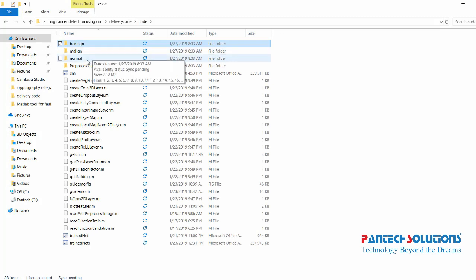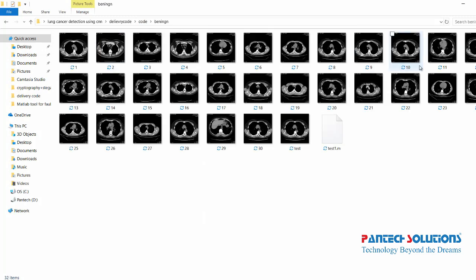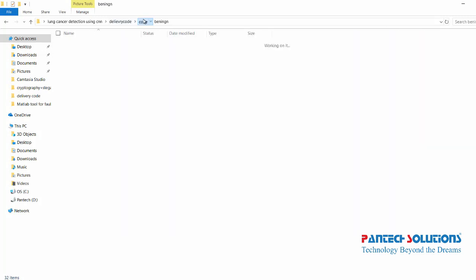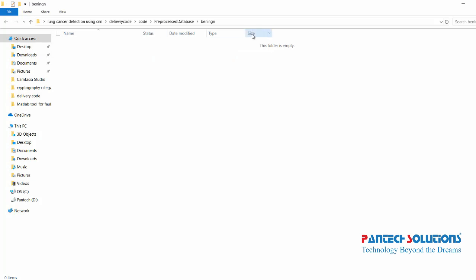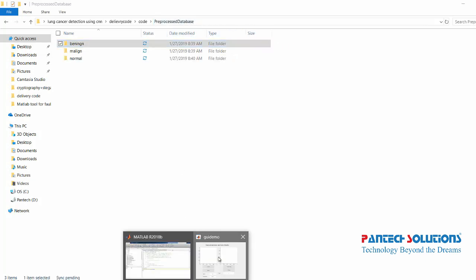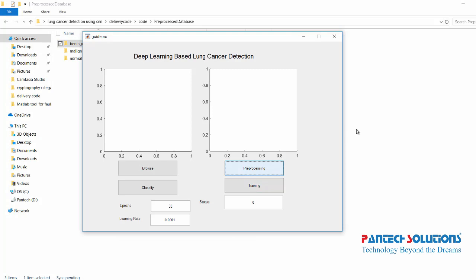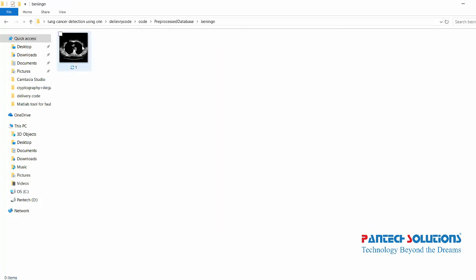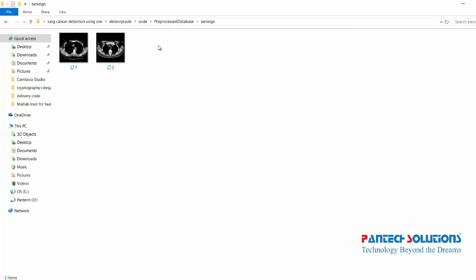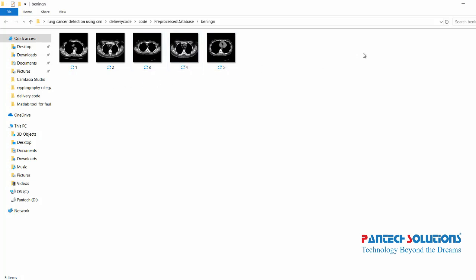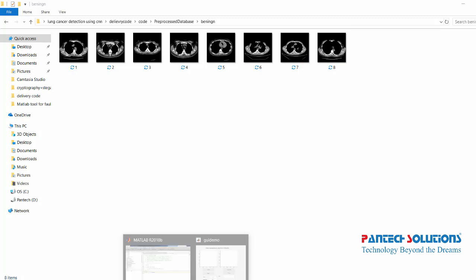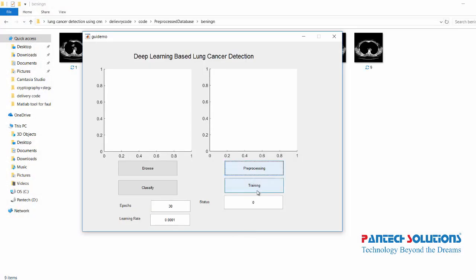The first step in this project is pre-processing. In this project we have used 60 images: 20 images for benign, 20 images for malignant, and 20 images for normal used for training, with the remaining images used for testing.